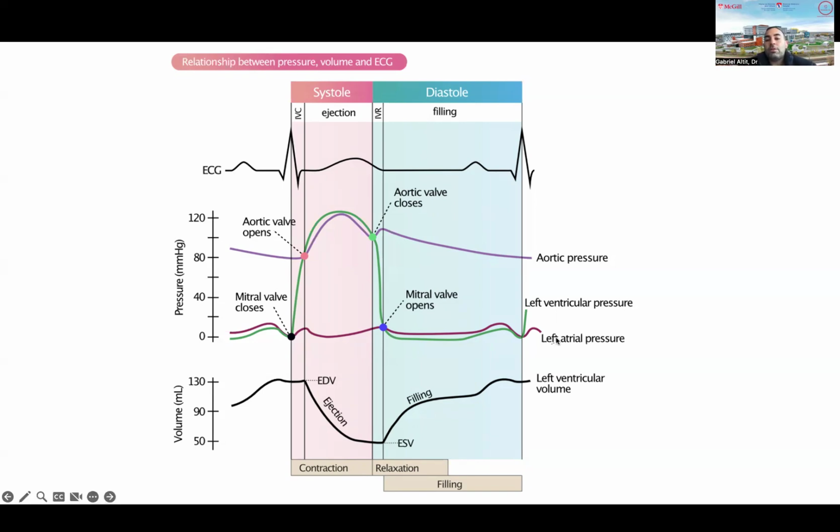So you would start with the left atrium, which has in general these very tiny pressures. And eventually you enter the LV where you see the curve into the left ventricle. And eventually you go through the aortic valve and you can measure, well, you probably not go through the aortic valve. You probably put your catheter in your femoral artery and then go into your aorta and then see your aortic pressures. And so these values will become very dependent on what's happening at the LV side or what's happening at the left atrial side.